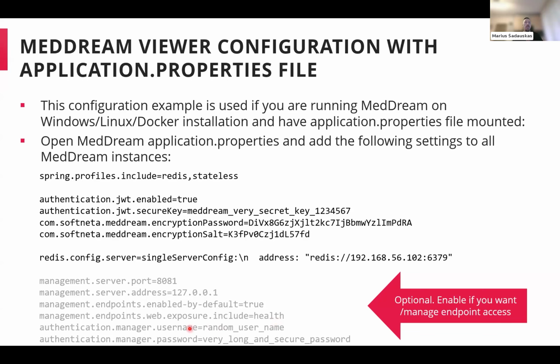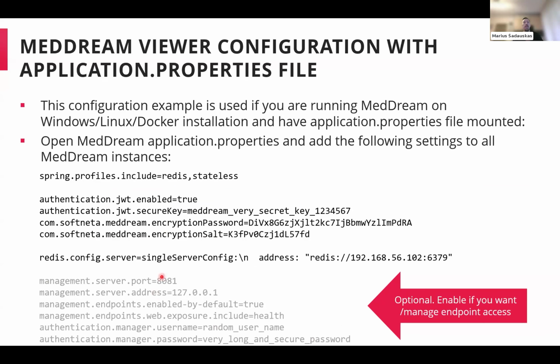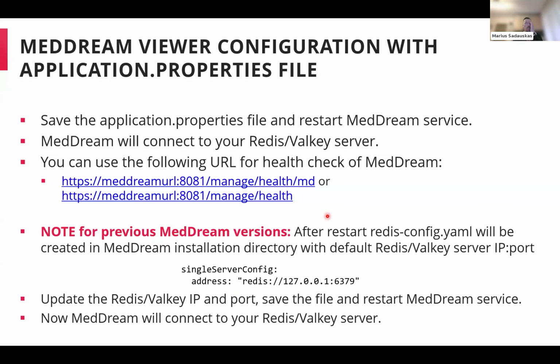Of course, again, you need to put a strong username and password, and you will be able to access the manage endpoint and check the health checks. Here is an example of the URLs of these manage endpoints if you enable this management IP, port, and all these other settings.